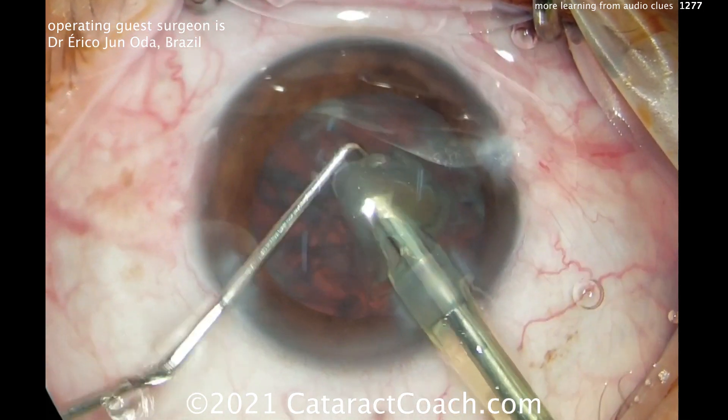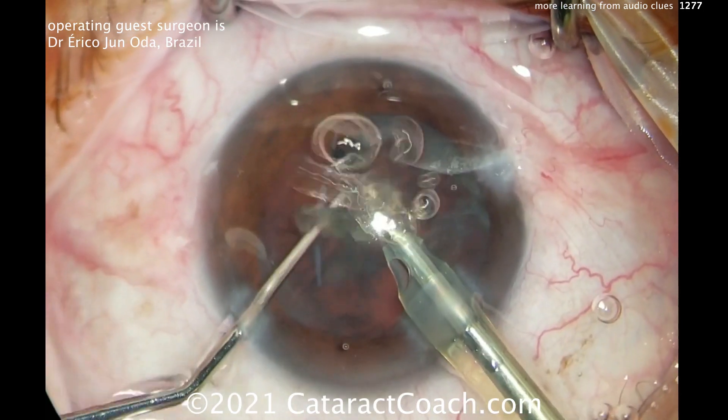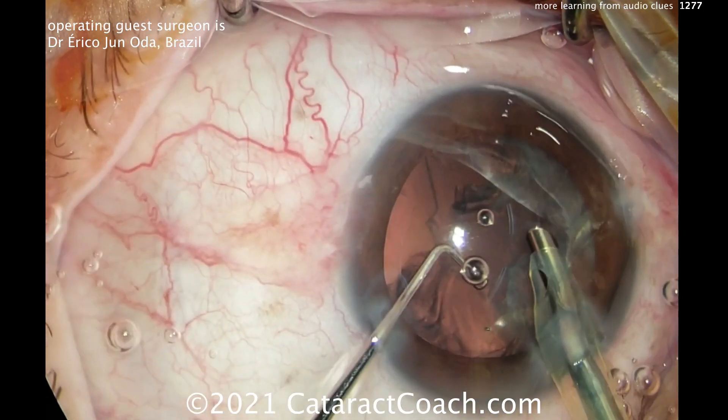The key here is the vacuum level — that's the most important clue. And he's titrating his foot. Another important concept: he doesn't go on and off the pedal. It's not pedal up, pedal down, pedal. No — it's titrating the pedal.